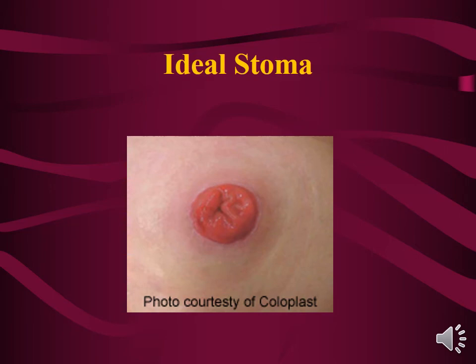And this is a reminder of an ideal stoma, and you're not likely to see these very often, but if you do, you should appreciate the beautiful work of the surgeon because these are not common. The other things that you see are fairly common, and this is what we deal with as ostomy nurses. And so when you see these kinds of things, hopefully you have an idea of what we do, and you will make referrals to ostomy nurses and definitely be doing your assessments.